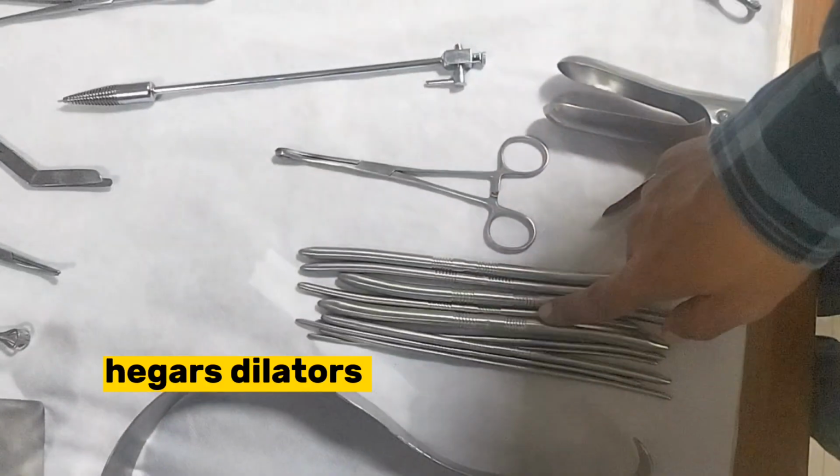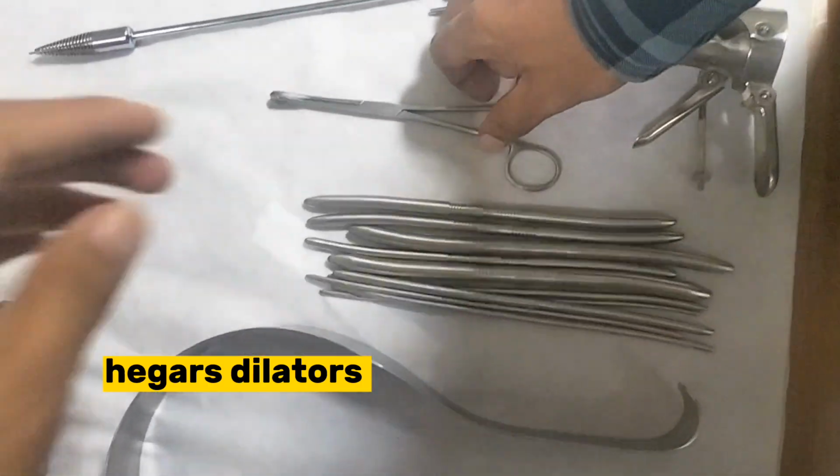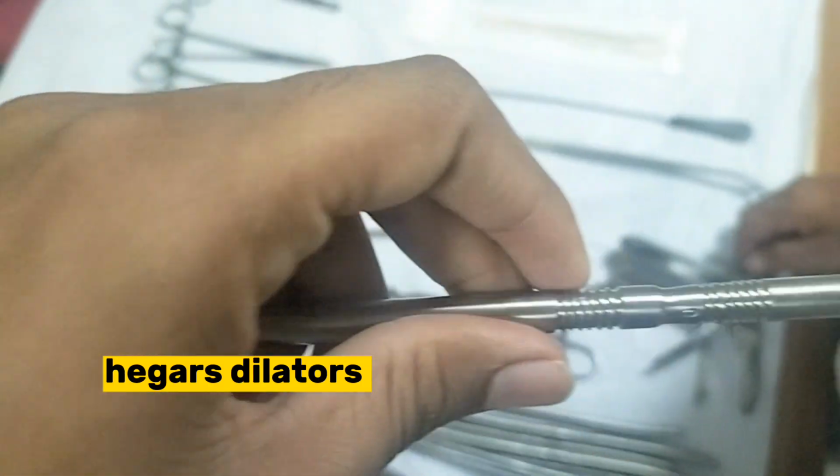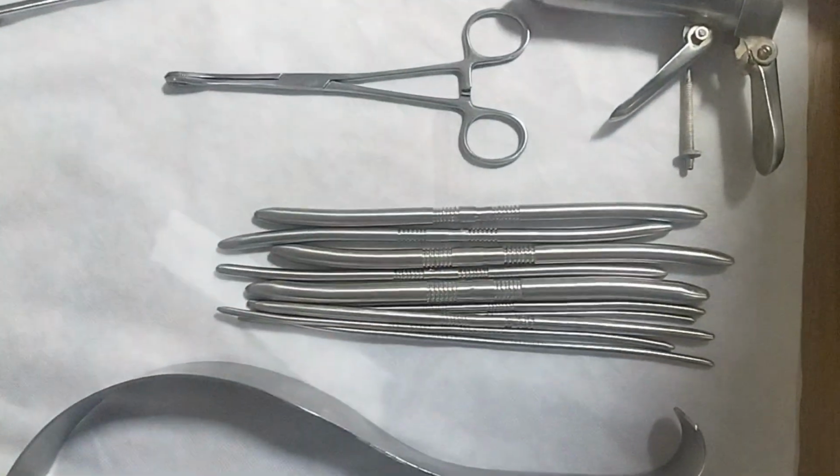Next. Here we got Hegar dilators of different sizes used to dilate cervix. Okay, and you can see on Hegar's dilator, every dilator has a marking. You can see the numbers are there. These are different sizes of Hegar's dilators.